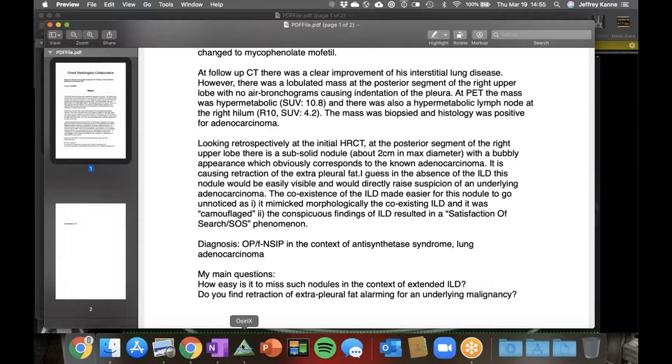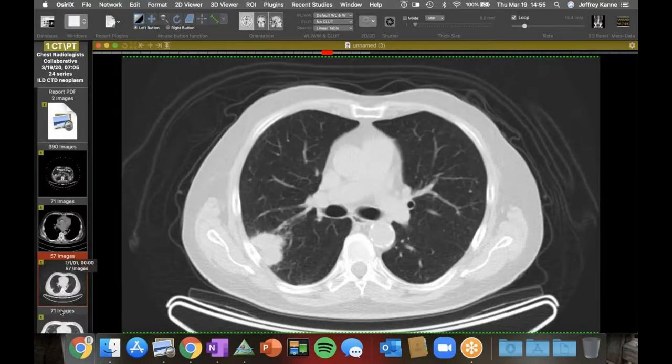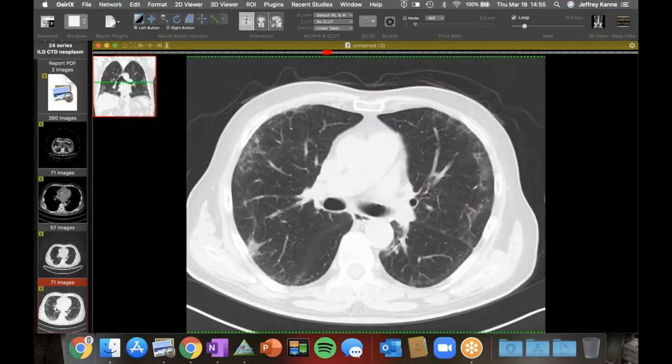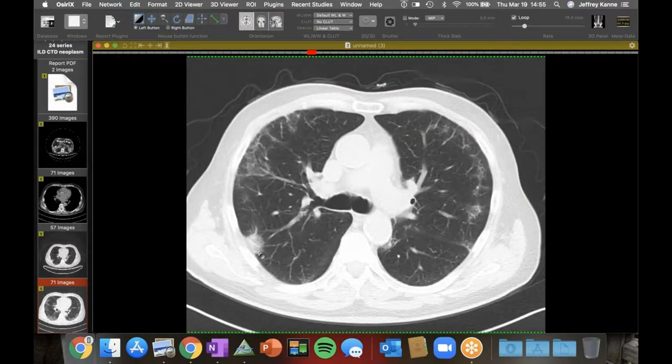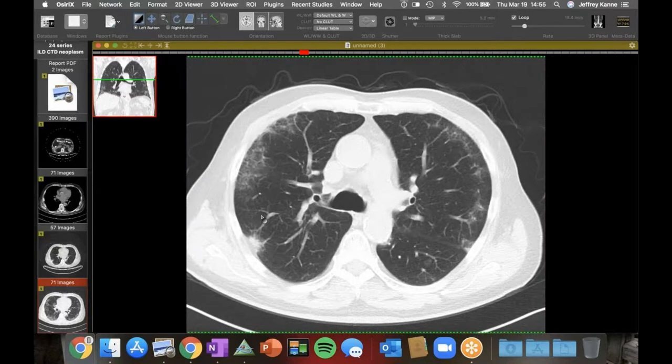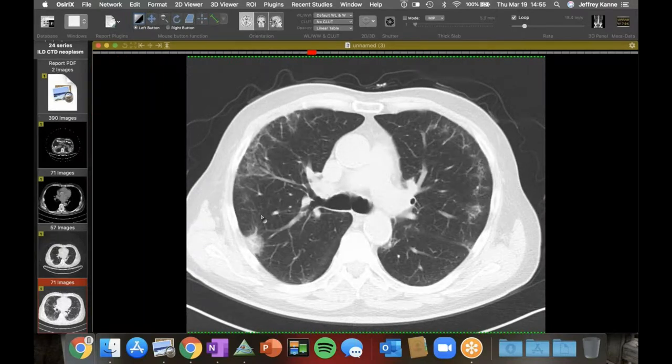I find it pretty easy to see this one because there's not a lot of fibrosis in that location. It's a little higher up and it looks morphologically very different, but you can imagine 6 months, a year ago, it may have looked very much like this. And we've seen cases where you get conglomerate fibrosis that is hard to distinguish from a neoplasm. We end up just following them. Sometimes the coronals and sagittals are helpful because they're more straight or triangular looking.